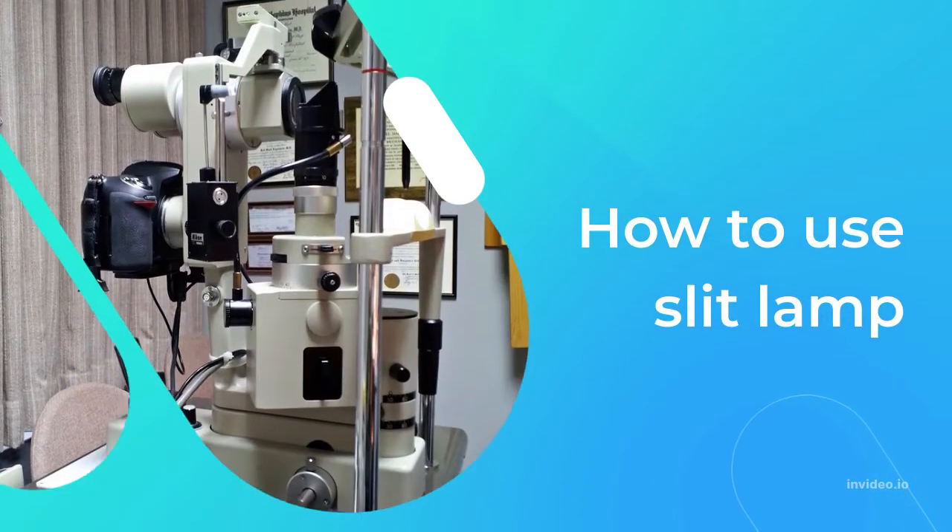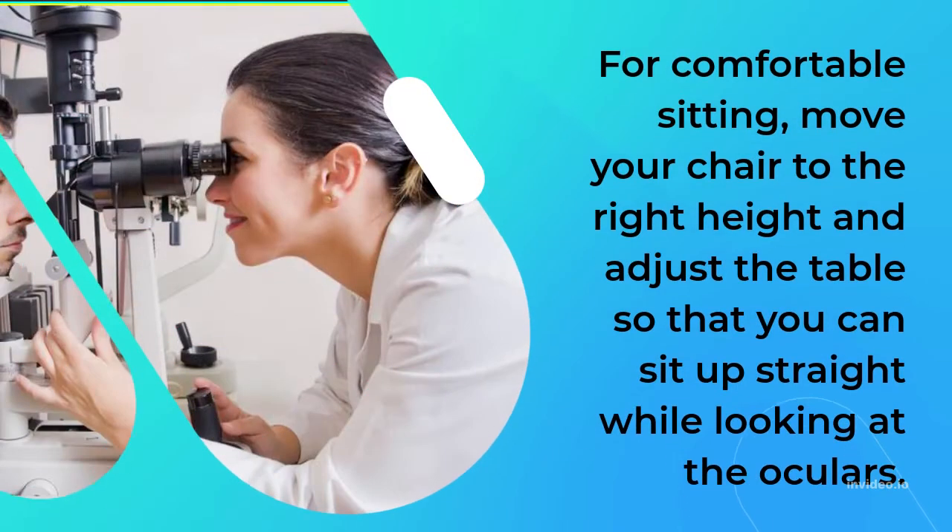For comfortable sitting, move your chair to the right height and adjust the table so that you can sit up straight while looking at the oculars.